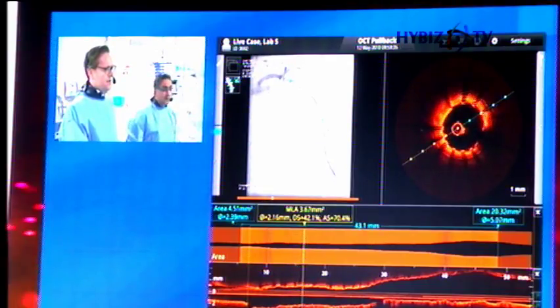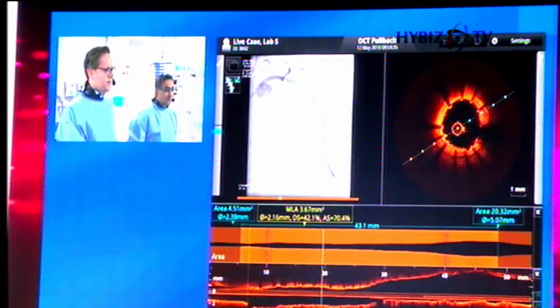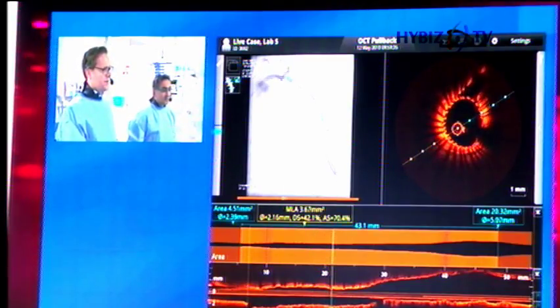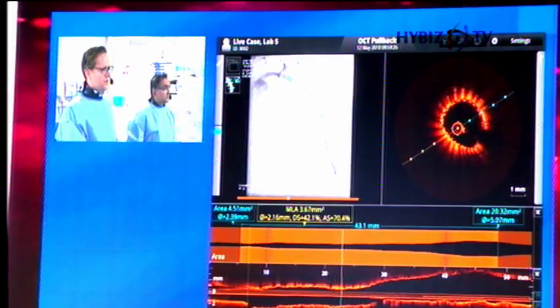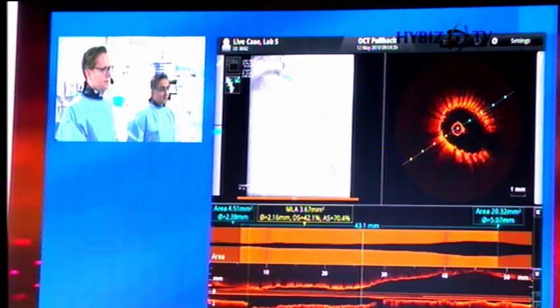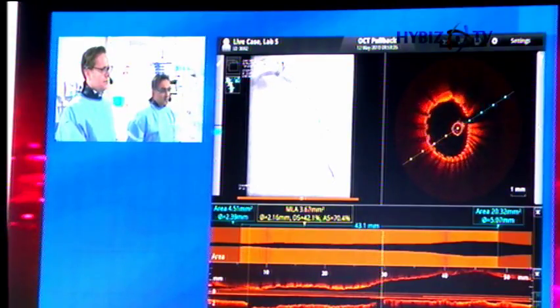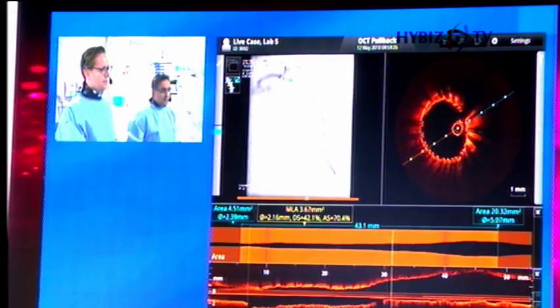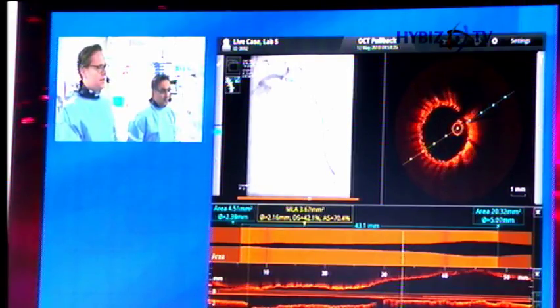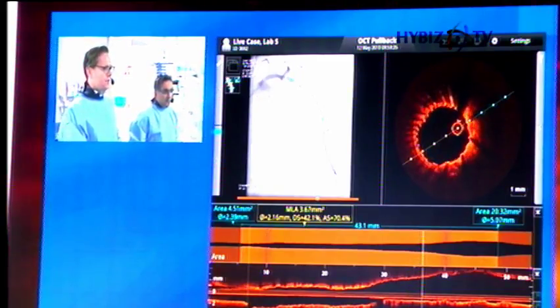There'd be a major risk here because of the diffuse atheroma that goes distally. We really didn't want to split the vessel, because then you could easily end up having to stent all the way down the vessel. And is it just me, or is the difference between this stent and conventional balloon expandable stents that the struts are less embedded, they're just up against the wall? No, they will embed, because they oppose very, very closely against the wall. So they absorb in exactly the same way.